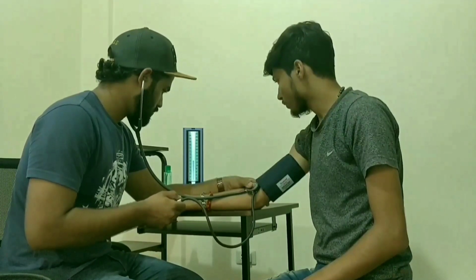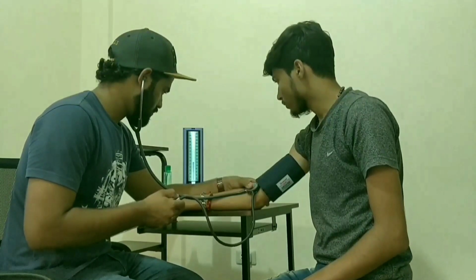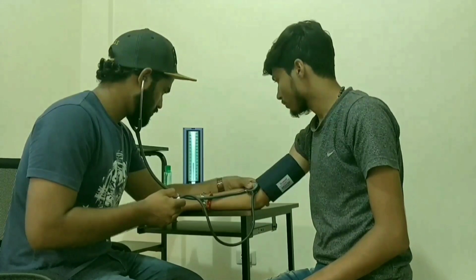So after inflating the cuff, you will deflate it at the speed of 2 to 3 millimeters of mercury per second, and when you hear the first sound, that would be your systolic pressure, and when the sound disappears, that would be the diastolic pressure.